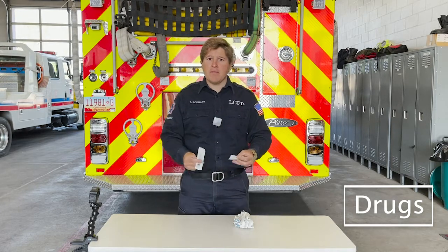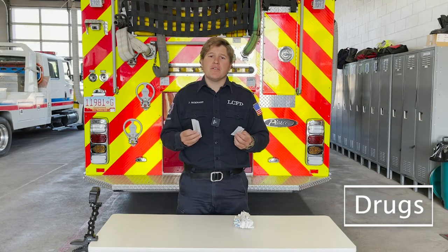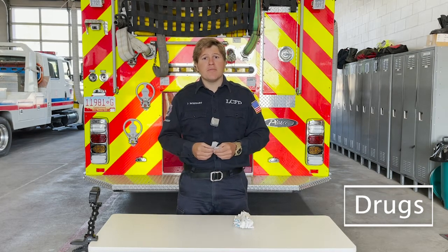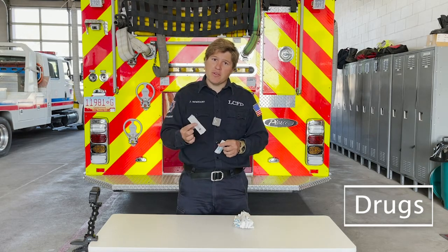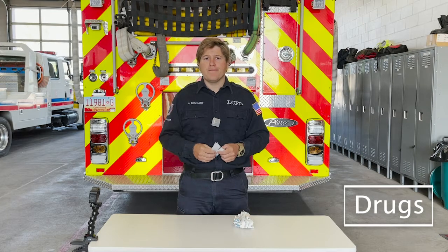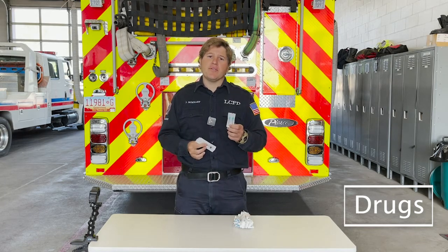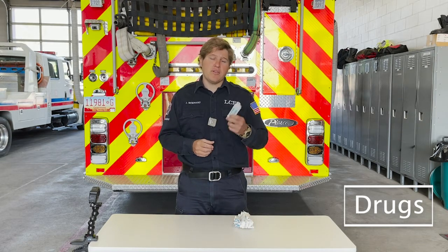Two pieces of equipment. It's pretty easy. Once you have the narcs, you're going to need needles and you're going to need syringes. So make sure you have those with you. In our case, the drug of choice, and the drug that Dr. Diven says, is Versed. So make sure you have that. Make sure you have the syringe that is appropriate for the amount you need to pull up. Don't grab a 20 cc syringe. Usually grab a 3 or 5, which might get you through that. So make sure you have the right syringe and the right needle, so that if someone does start to need sedation, you're able to provide it quickly.